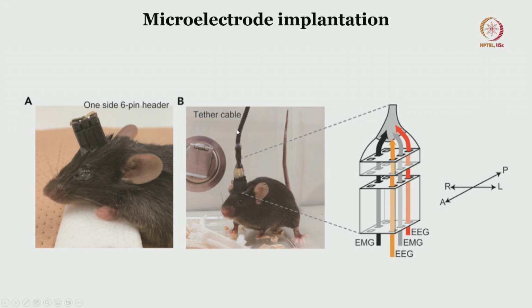And then you can have a wireless electronic setup here, which is the ideal situation, and will give the rat much more freedom to walk around and do all sorts of activities if your experiment has a lot of behavior experiments involved. A tether cable does affect the movement a little bit, but by and large you will be able to manage and get good electrical signals, alright.